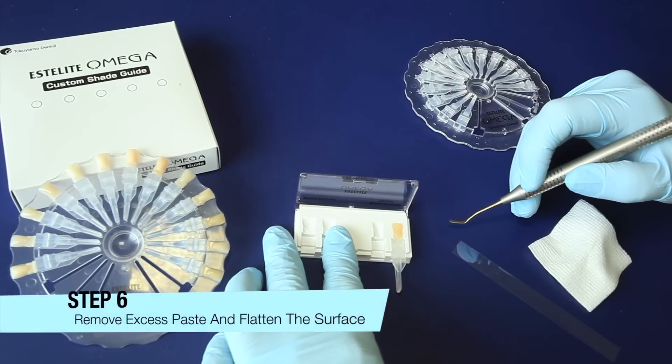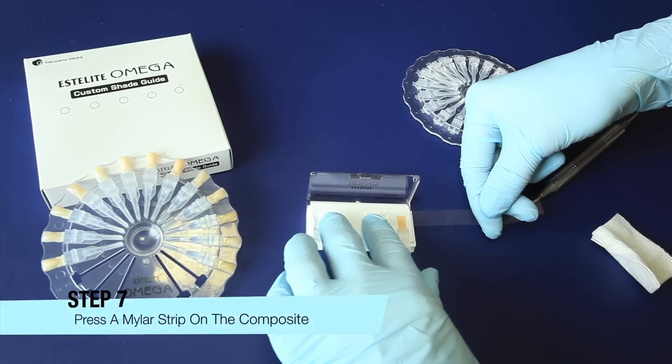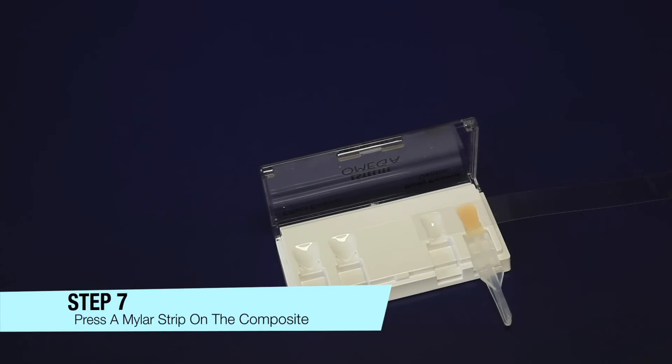Step 6: Remove excess paste and flatten the surface. Step 7: Gently press a mylar strip on the composite to be cured.